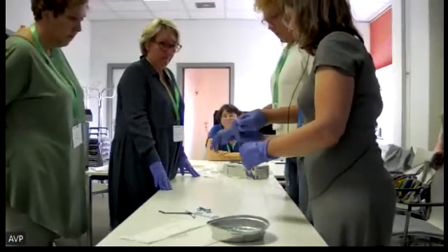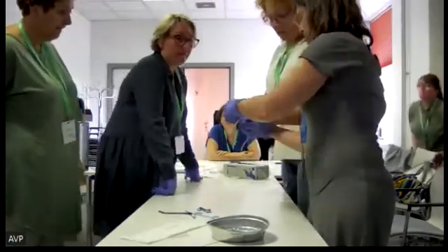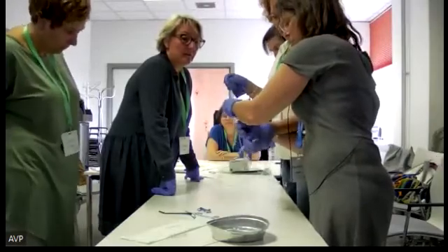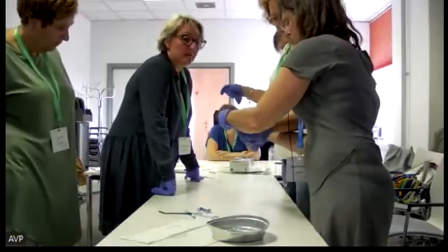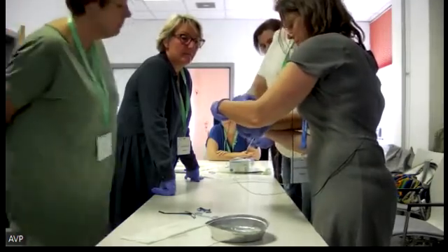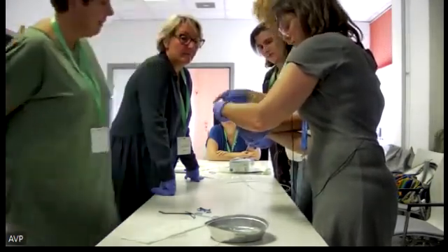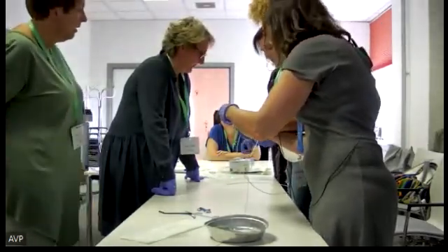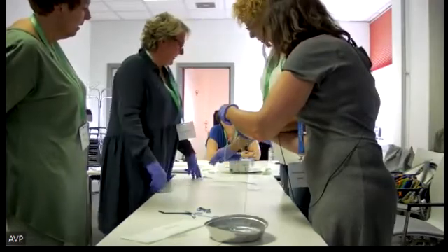I have this in the endoscope, and then I keep this like this, and then I push down. But so you end up seeing only the guide wire and this. So you see, this one is very souple, flexible. So you can push the end of the wire in, you remove the stylet and push this one up, to help you.